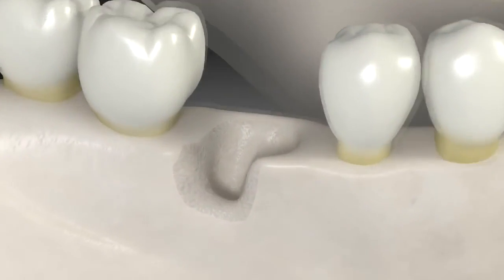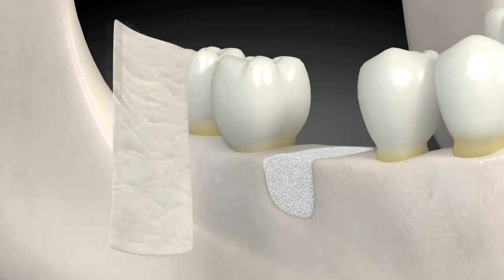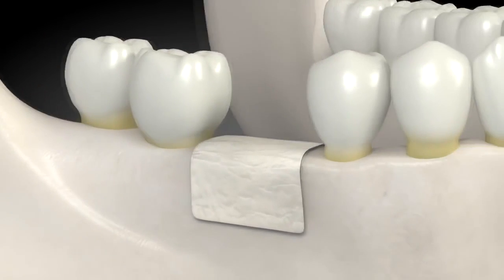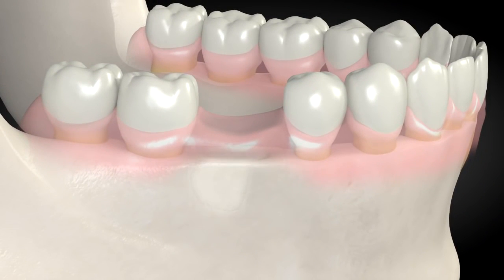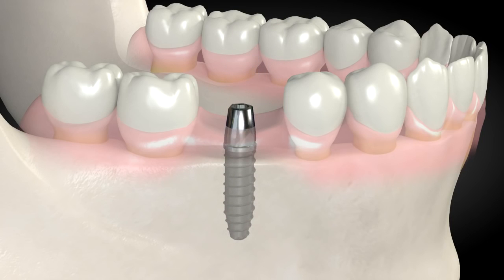When it is not possible to use a block, a softer mix of bone substitute is placed where bone is missing and covered with a tarp called a membrane. This graft also grows bone. When the bone heals, a dental implant is placed and allowed to heal, and the final tooth is placed on it.